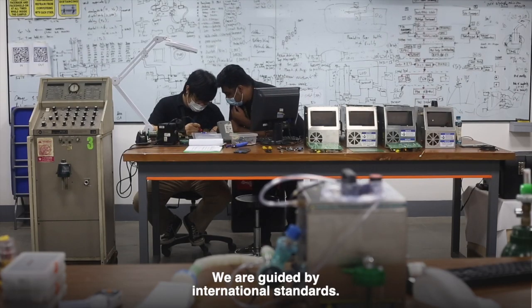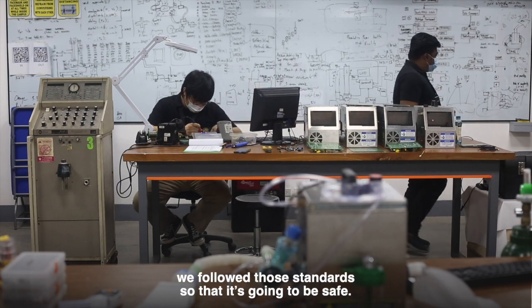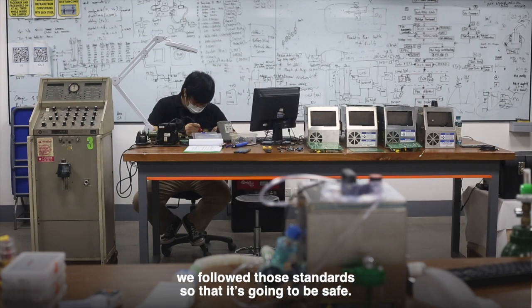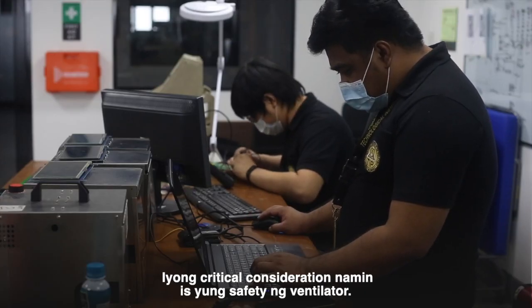We are guided by international standards. The parameters and features of our ventilator are designed to be safe — safety is the critical consideration.